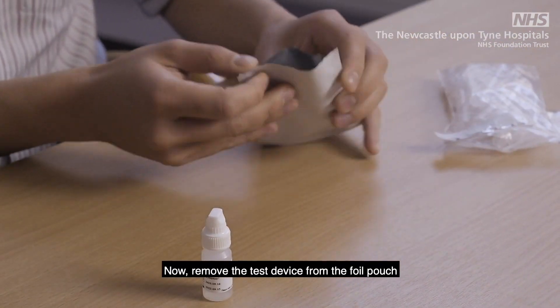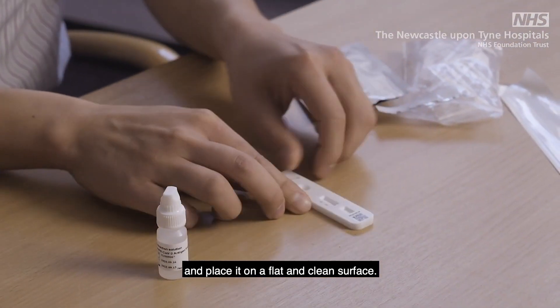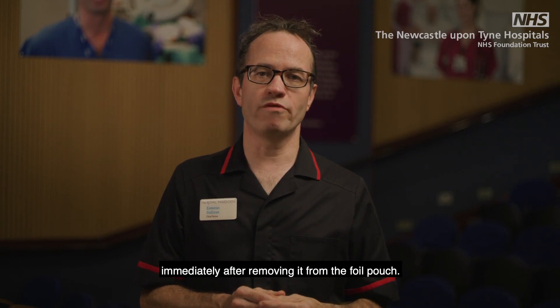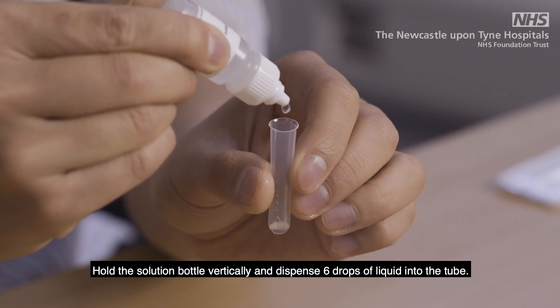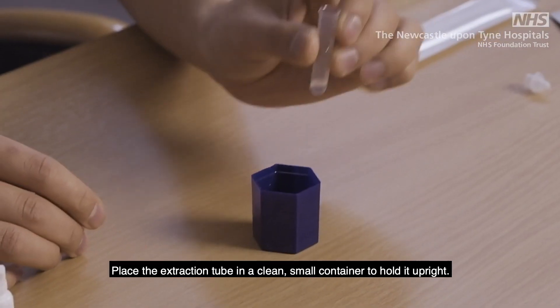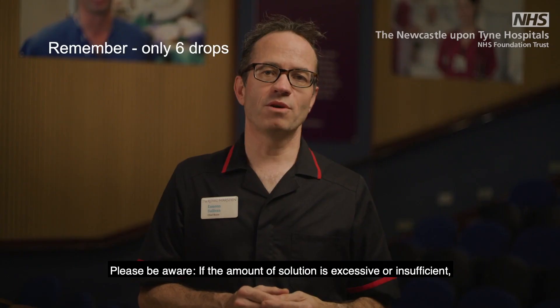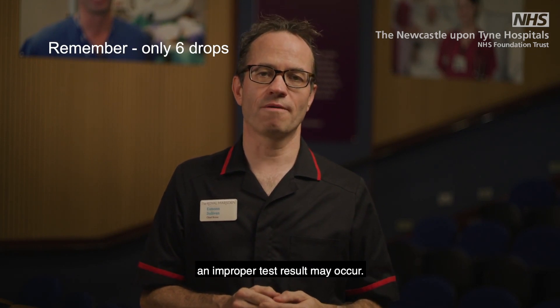Now remove the test device from the foil pouch and place it on a flat and clean surface. Please remember that the test must be performed immediately after removing it from the foil pouch. Hold the solution bottle vertically and dispense six drops of liquid into the tube. Place the extraction tube in a clean small container to hold it upright. Please be aware that if the amount of solution is excessive or insufficient, an improper test result may occur.